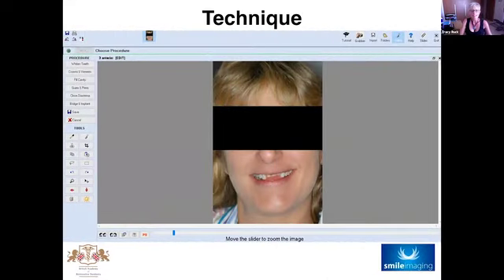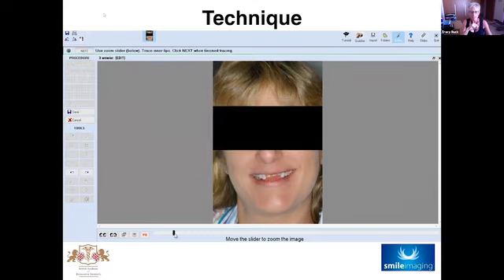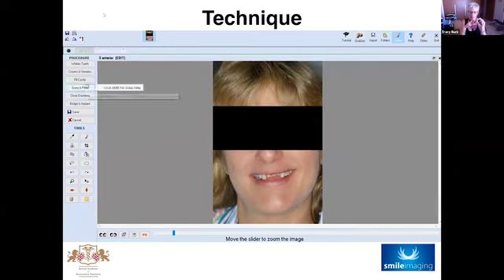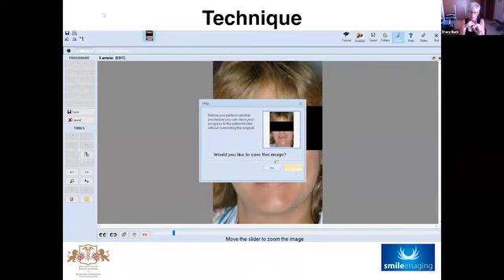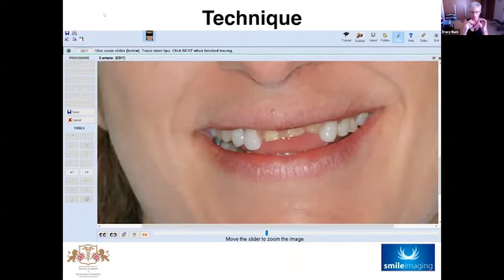So let's look at that technique a little bit more closely in action together. So we're going to click on crowns and veneers, and obviously we've looked at it from a full smile makeover earlier, but we'll look at it as a close-up. So I've drawn wiggly lines there, and that is by holding the mouse down and just moving it around. As I mentioned before, that's really difficult to go around the lip line.